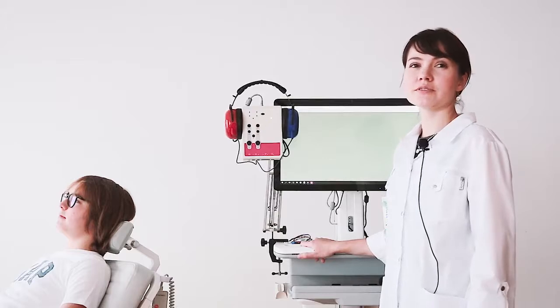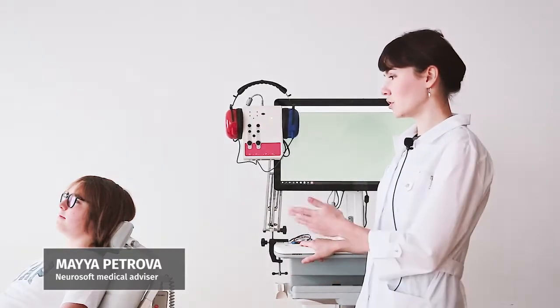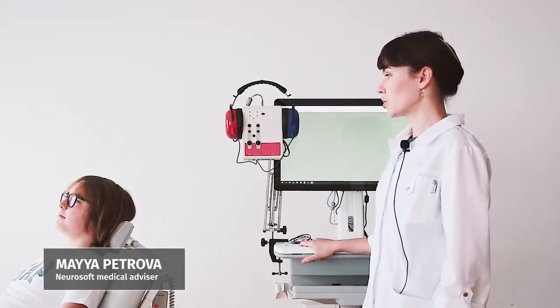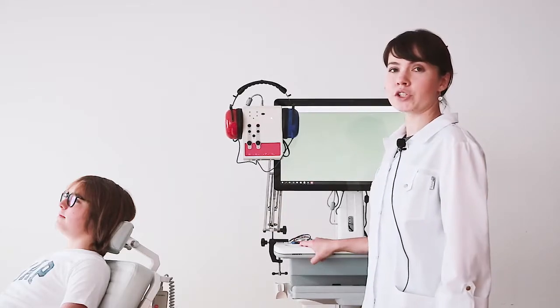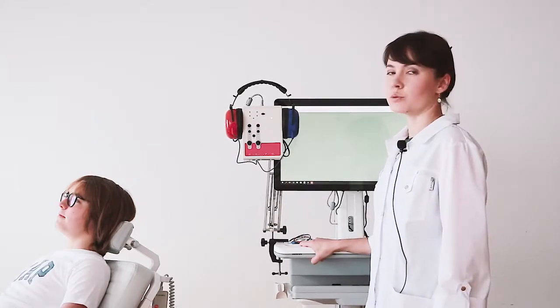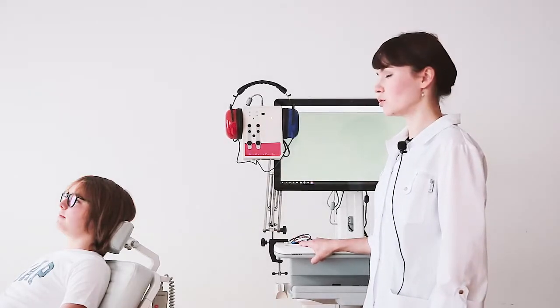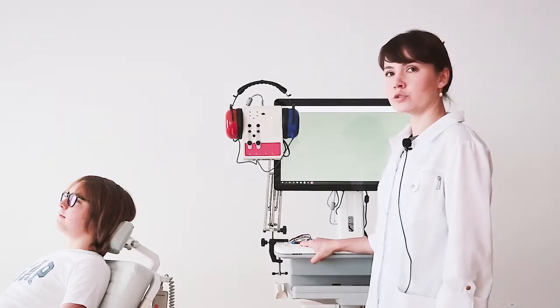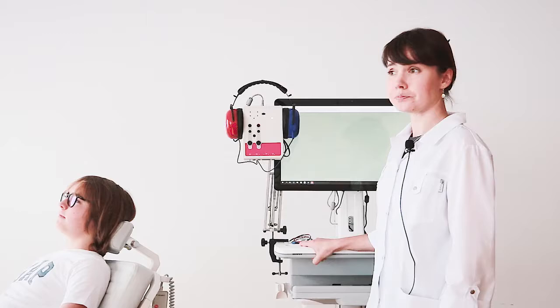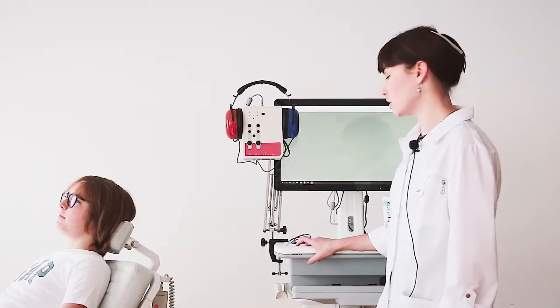Now let's continue with the auditory brainstem responses. Before performing this test, we need to check if our patient is fully relaxed, especially his neck and face muscles. If your patient is a child, it will be better if he or she sleeps during the procedure. And our room must be well soundproofed and have a good grounding for this test.